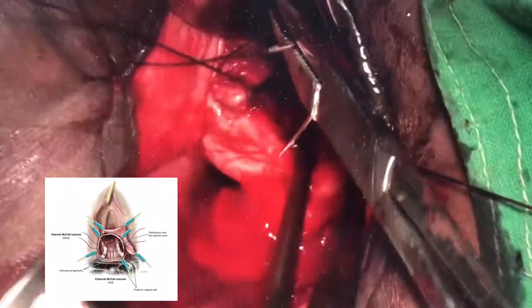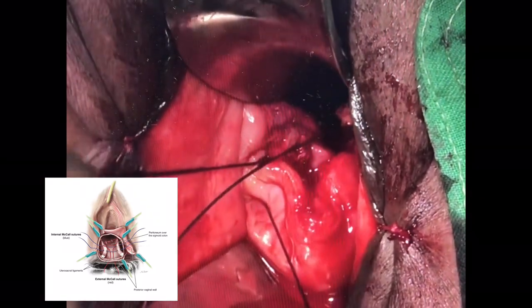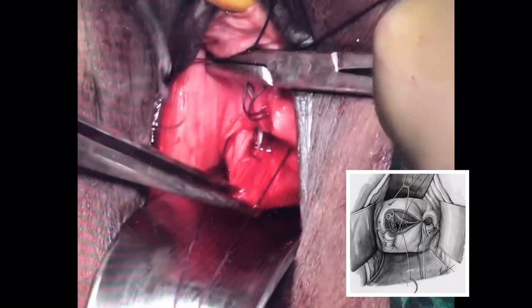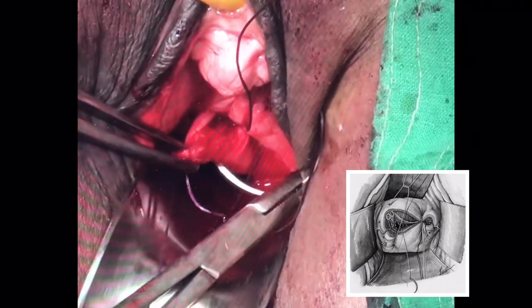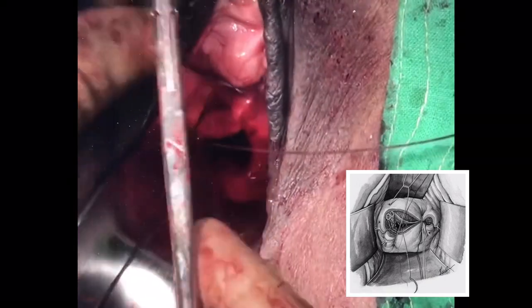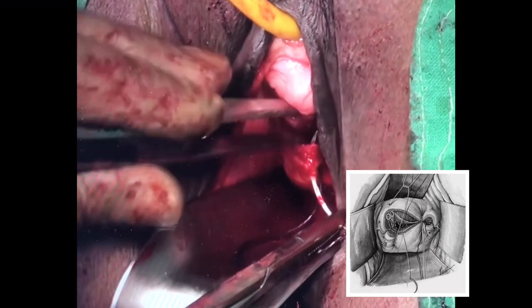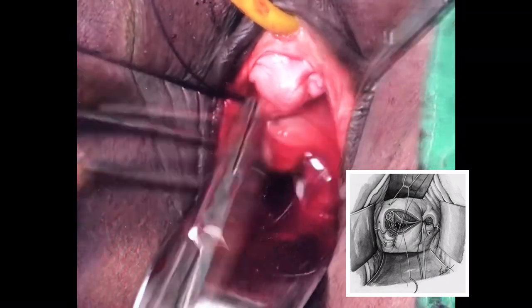Here we are going through the final angle. The Sims speculum has to retract the rectum properly. Now both the uterosacral pedicles which were kept long are tied to each other, giving effective shortening of the uterosacral, and this same uterosacral will subsequently be attached to the vault. If any anterior repair has to be done, it must be done before this step. We are going through the center of the vault, going deep first and then the superficial edges. The uterosacral pedicles will be tied after the vault has been sutured, giving the effect of an internal McCall stitch.